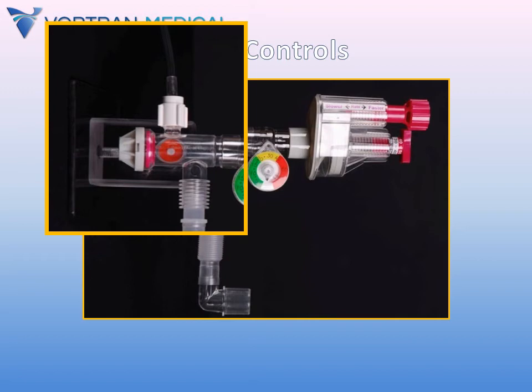This is one of the factors that determines your I time, or inspiratory time. For example, we usually set the VAR at 10 liters a minute. If we only have 2 seconds before the diaphragm opens, allowing the patient to exhale, I have a 2-second I time. And at 10 liters a minute, that represents 333 milliliters of oxygen. My tidal volume would then be 333 milliliters of oxygen.